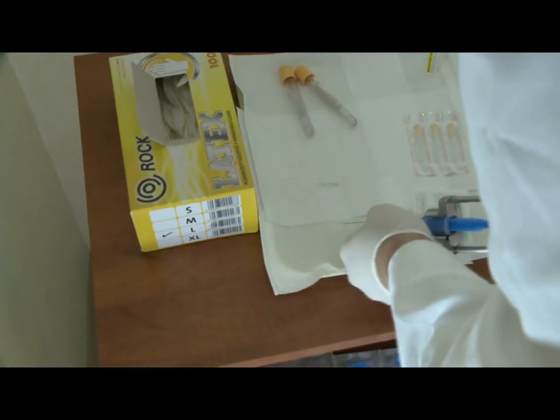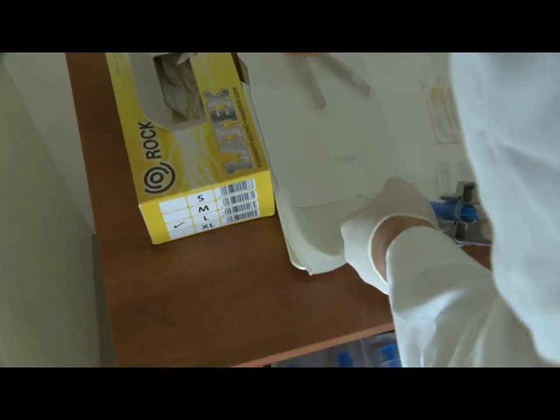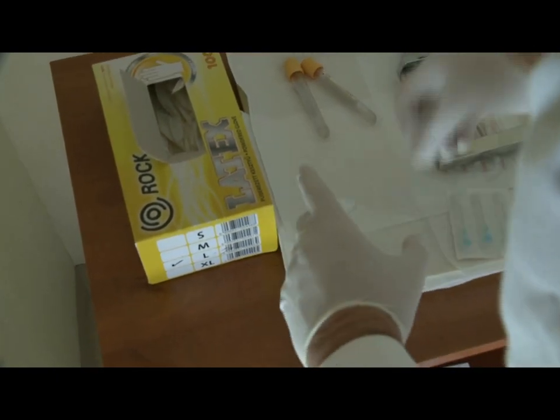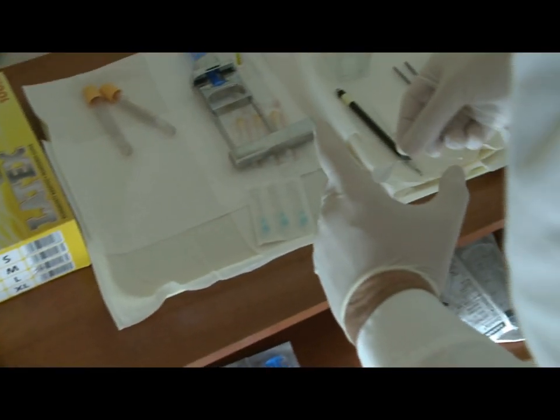We have done the sampling and now we are preparing the smear. We spread the specimen onto the slide and smear it using another slide. Thereafter we place the prepared smear into alcohol for fixation.